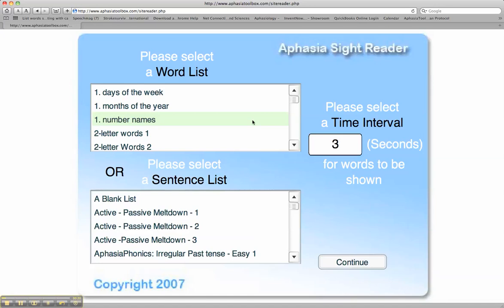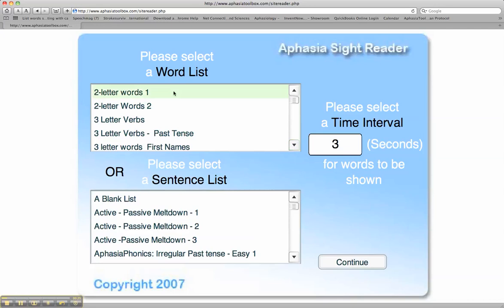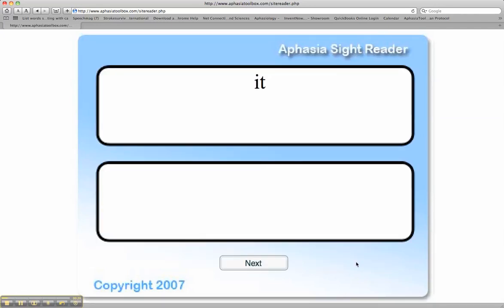Under the word list, select a word list that corresponds to the patient's basic abilities. Let's start with the two-letter word list. The word will be exposed for three seconds. The client is then to type the word from his or her memory.